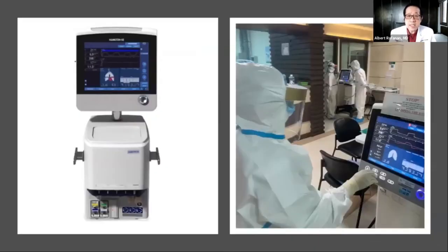Okay. This is our ICU. This is the ventilators we use. We're fortunate that we have the Hamilton G5 and we use it intensively in all of our patients. And this is actually our COVID ICU, if you notice this. We were able to move our ventilators outside the room where the patient is intubated. The compressor is in, but the monitor is placed outside, to try to decrease the exposure of healthcare workers to COVID, as we always do right now.